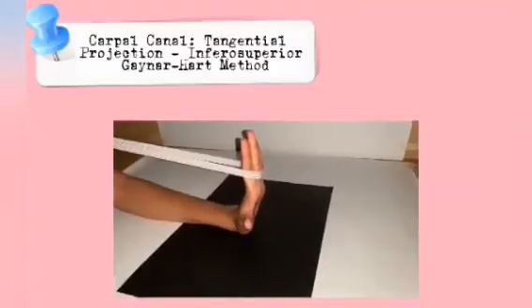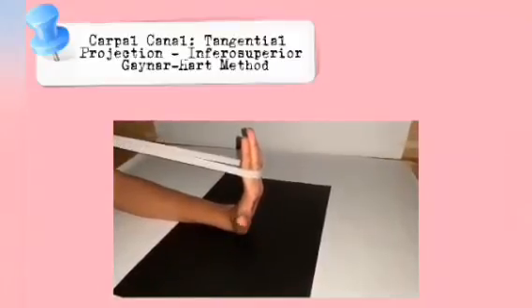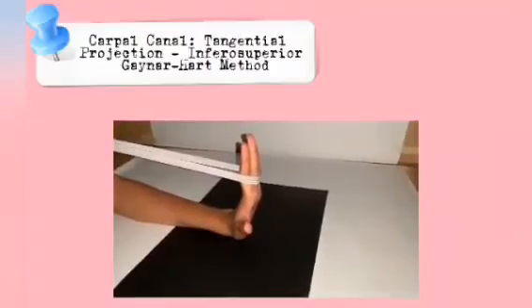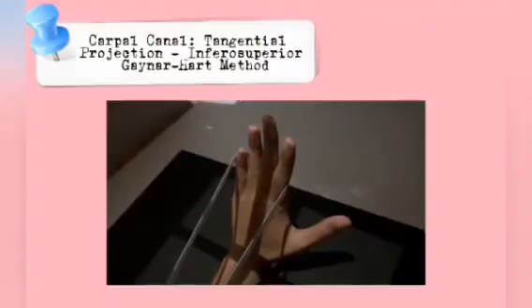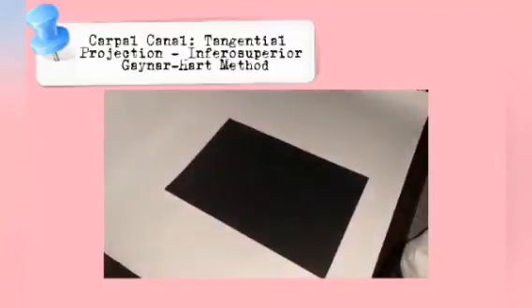Adjust the position of the hand to make its long axis as vertical as possible. To prevent superimposition of the shadows of the hamate and pisiform bones, rotate the hand slightly toward the radial side. Have the patient grab the digits with the opposite hand or use a suitable device to hold the wrist in the extended position.